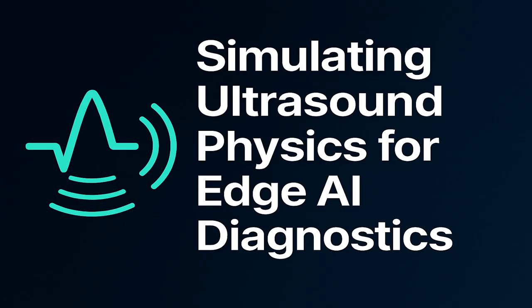Techniques like quantization-aware training or just meticulous post-training validation are required to ensure that the gain in speed doesn't compromise the safety or the efficacy of the diagnostic result. What other optimization strategies are employed to squeeze every last ounce of performance out of these engines?